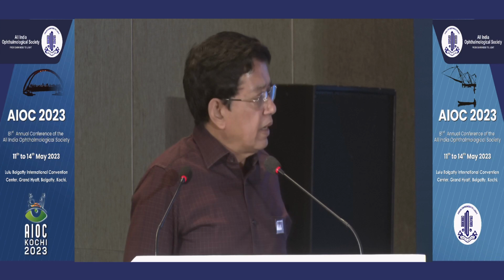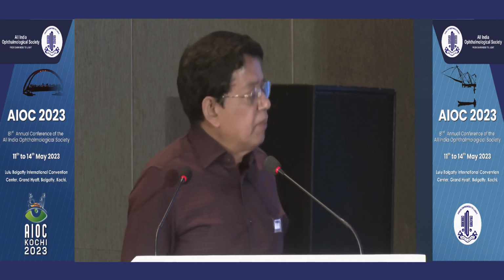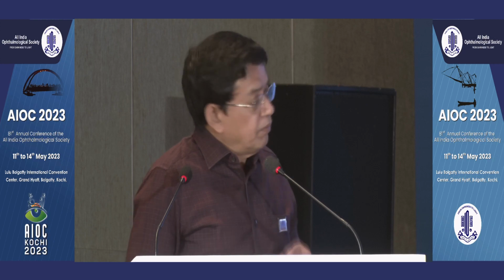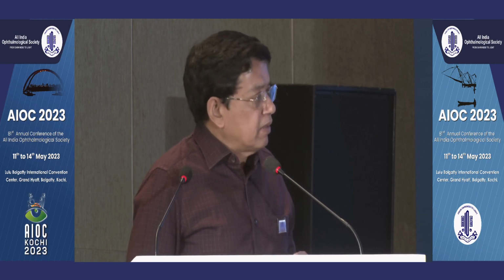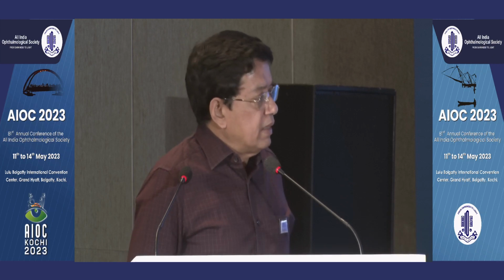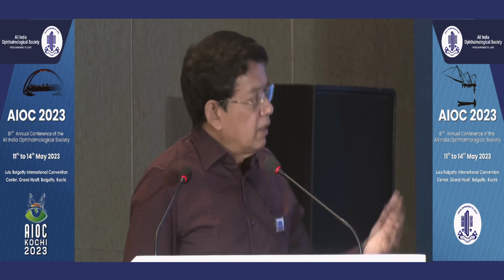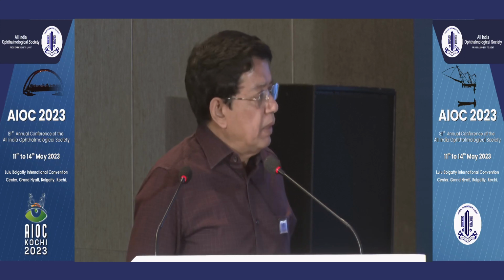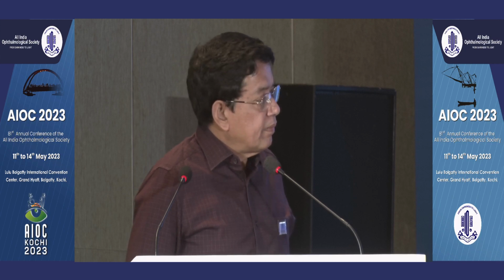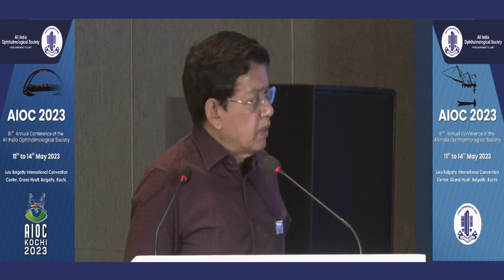I don't think I can comment on that because our numbers are very small with those lenses. But with IPCL, or with the bioacrylic, definitely the incidence of cataract is no higher than what you would get with an ICL. And all the tenets that you very nicely elaborated need to be observed even with these lenses. Okay. The indications and the examination and the pre-operative assessment are the same. Absolutely the same.